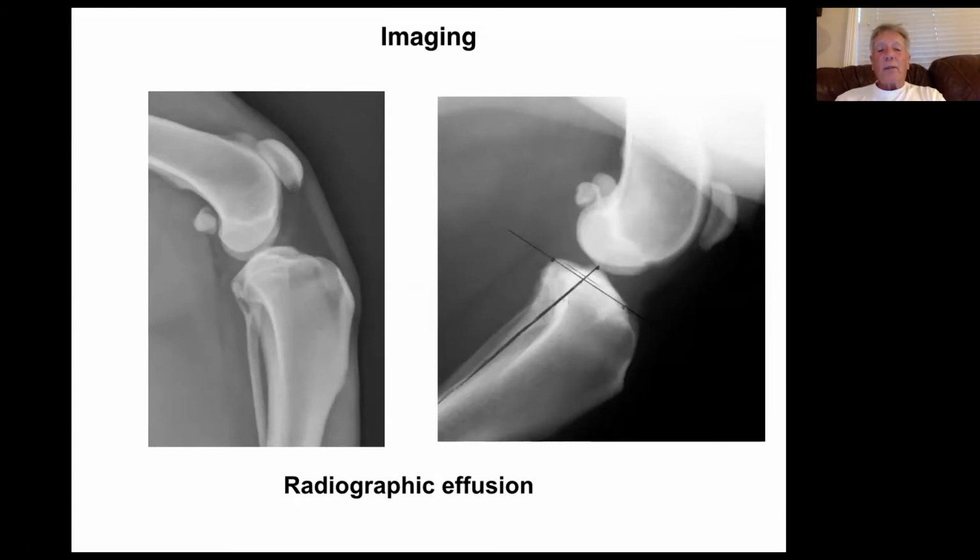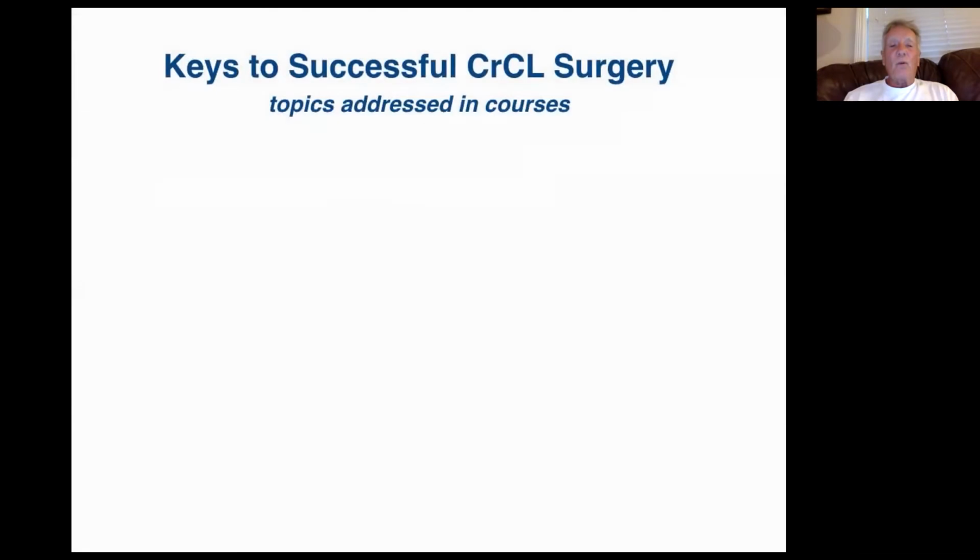It's close to the tibia. And more importantly, there are some little dark tributaries that come off of it going towards the center of the joint. That's normal. Look at the other image there. See how that line's moved back away from the tibia? And more importantly, you lose all those little tributaries. That all becomes homogeneous right behind the joint there. So abnormal sit test, abnormal imaging, that's an early ACL. No instability that you can detect in these dogs, but that's when you need to diagnose them. And we'll show you why in just a minute.